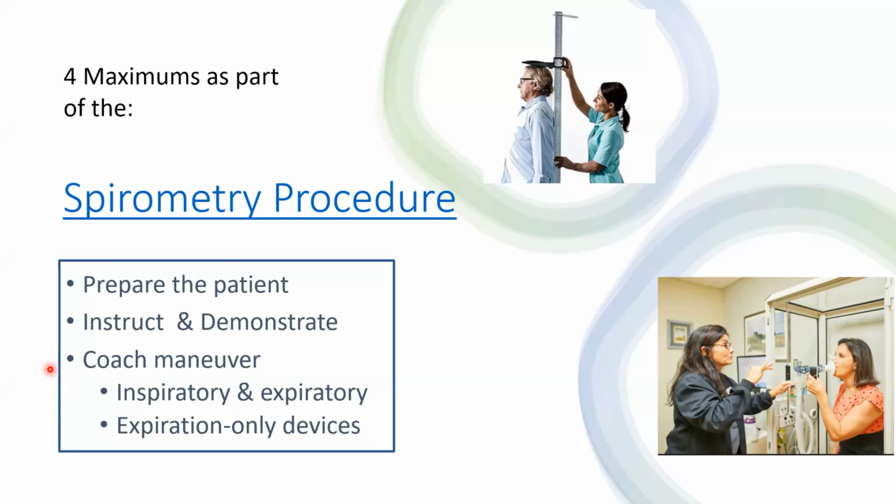Now, ATS/ERS prefers inspiratory and expiratory devices that measure both directions. But in home care, in physician offices, in public screening, there are a lot of expiration only devices. So we will just mention them briefly in passing.